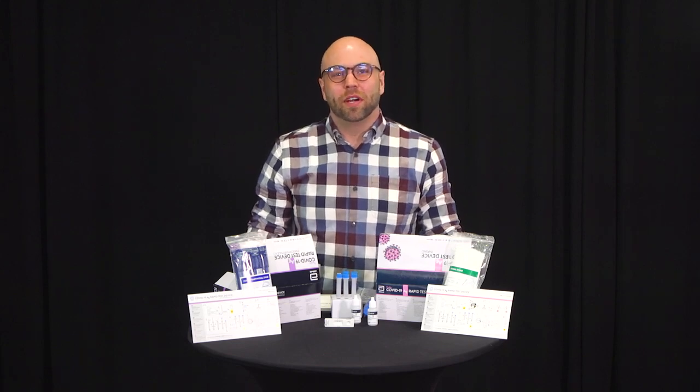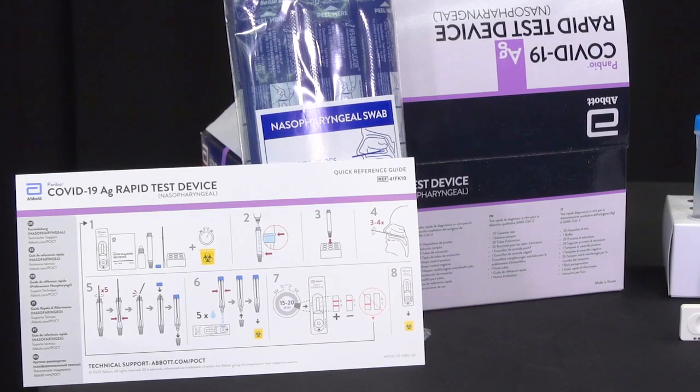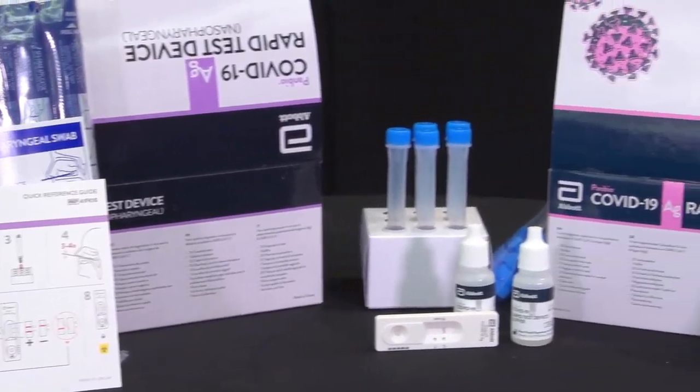Hi, my name is Matthew and I'll be giving you step-by-step instructions on how to perform a rapid antigen screen for each of your employees. I'll be using both the nasal and nasopharyngeal pan-bio test.